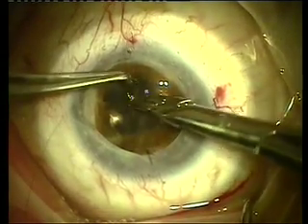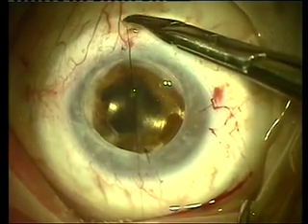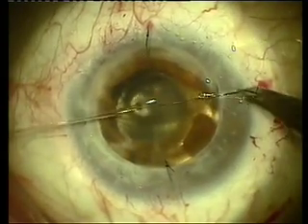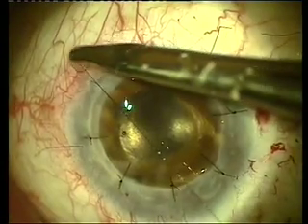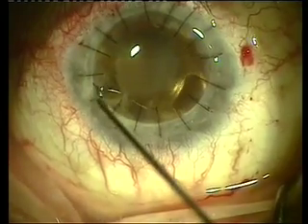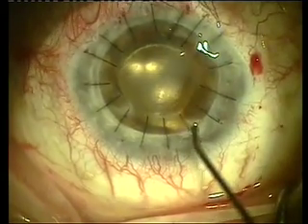Our first and second cardinal sutures are seen here. We're seeing the six o'clock suture placed now — we're obviously looking at the surgeon's view. The fourth cardinal suture is placed here. Here we're seeing the 16 completed interrupted sutures with all knots buried.